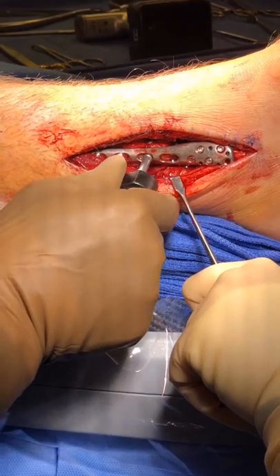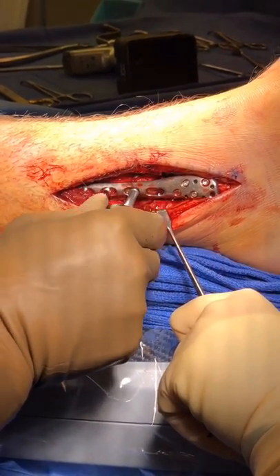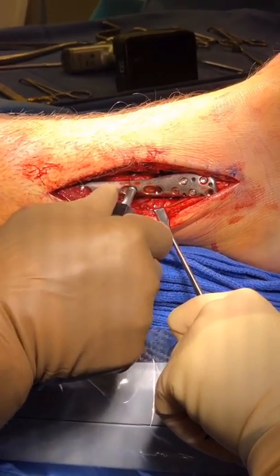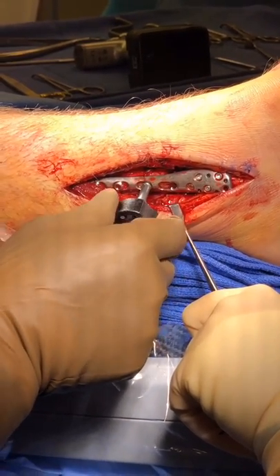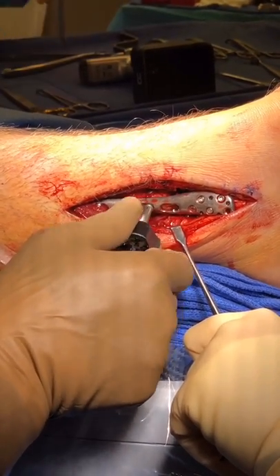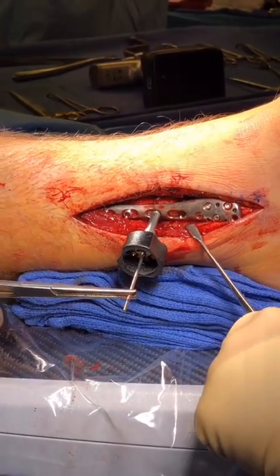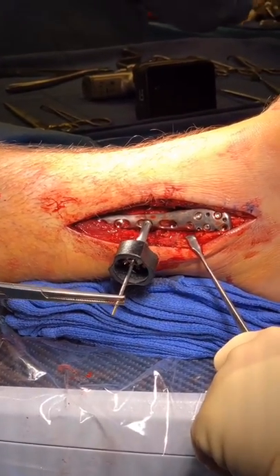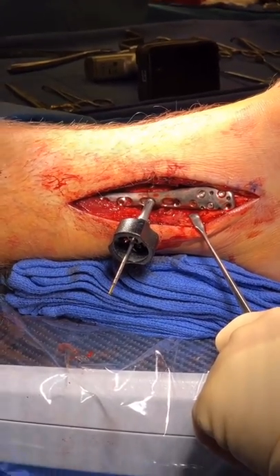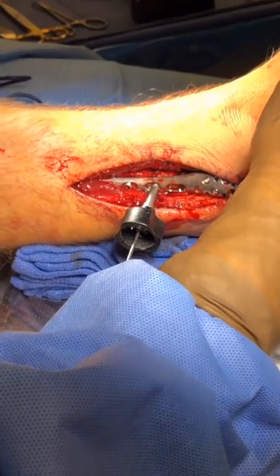And with the aid of fluoroscopy, we'll confirm that we have anatomic reduction of our syndesmosis. And we can simply turn it counterclockwise to loosen up the tension of the construct. So now we'll take some fluoroscopic views to confirm we're happy with our reduction of our syndesmosis.